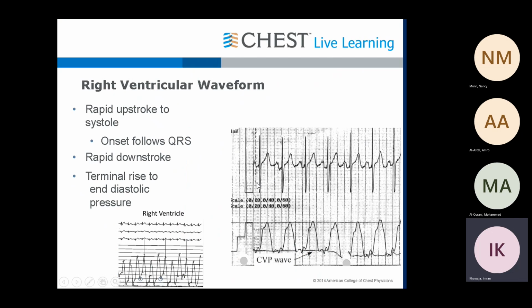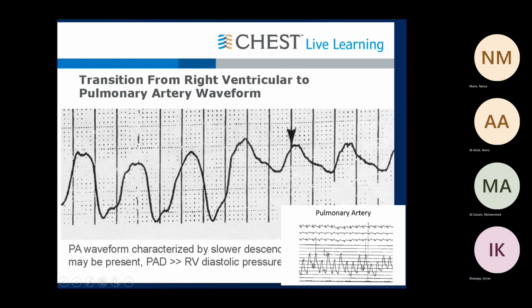Okay, this is again how it looks in real life. So this is the EKG, this is the RV systolic pressure and diastolic pressure.